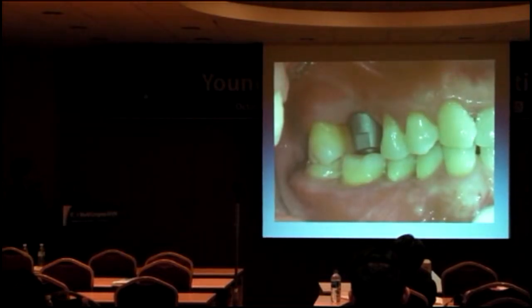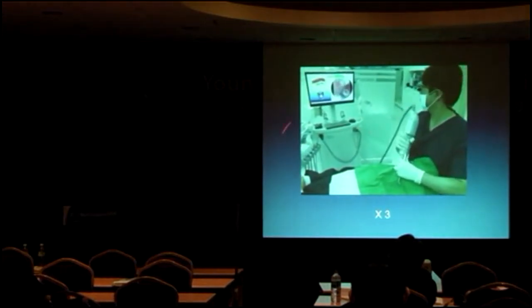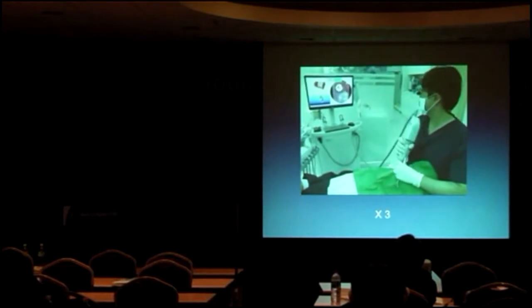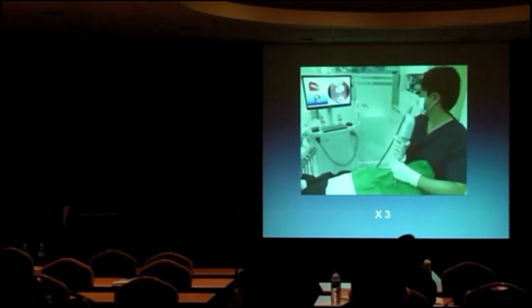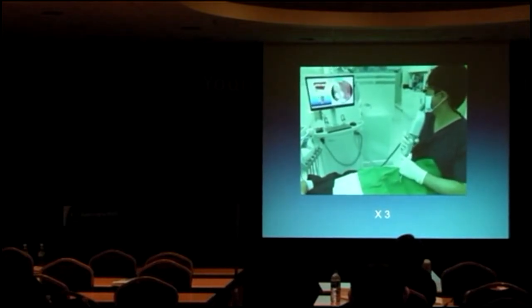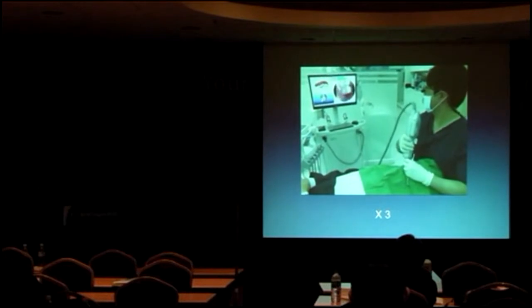So this is how it looks after the impression coping is connected. And this is how I made the impression. This is my clinic. I have four chairs in a row. And this is recorded and encoded three times faster because of the time limitation. So this is how it's working.